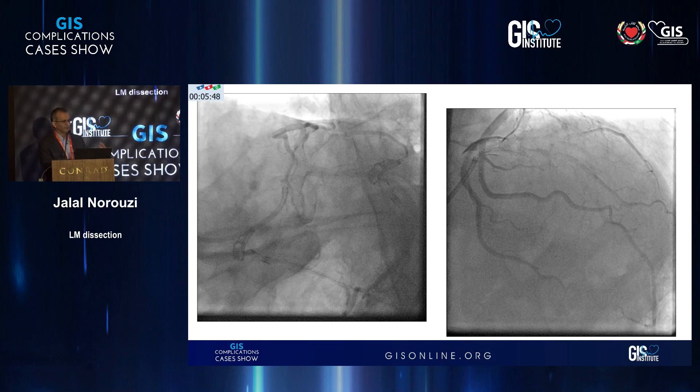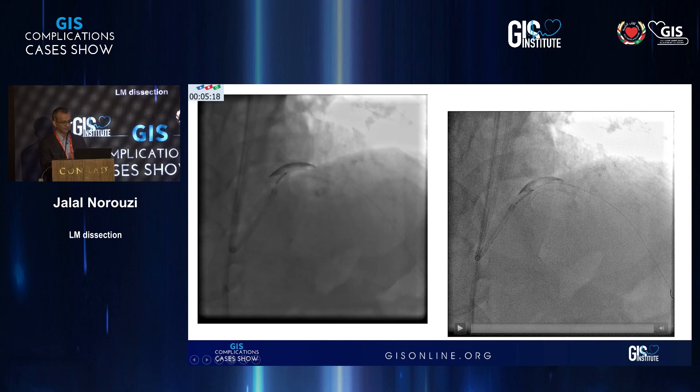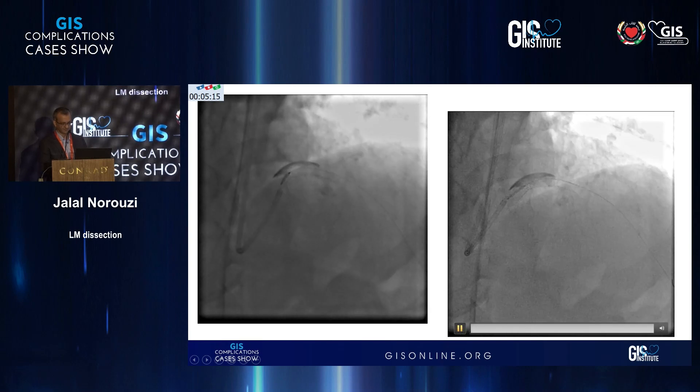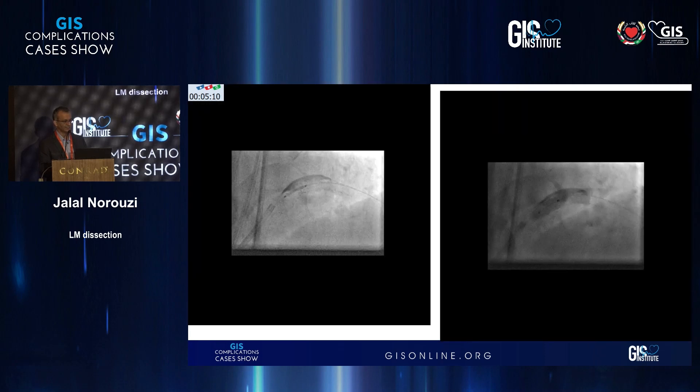In this cranial view, we thought perhaps the radial force of our stent was not so good because it was an ostial stent and we had over-expanded it to 5 millimeters. We thought perhaps a small stent positioned in the ostium would increase the radial strength. So from that same projection we passed the wire again — the stent passed smoothly and it looked okay. We weren't worried at that point and thought we were just going to reinforce the stent to make it more safe. This was another projection just to make sure.